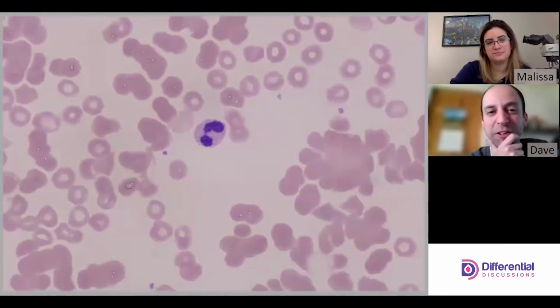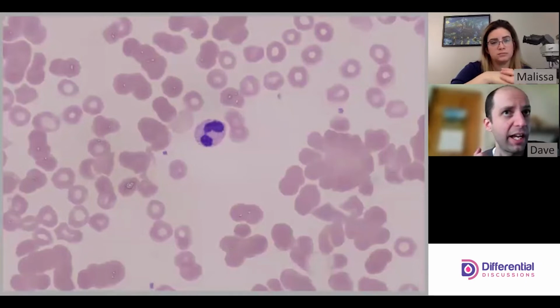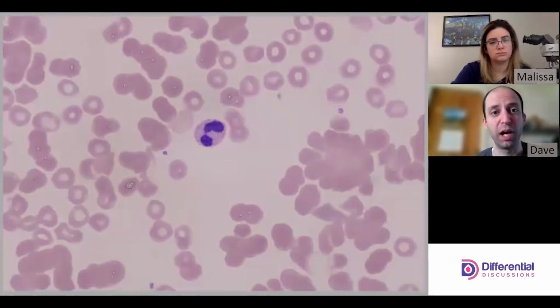Really cool slide, but this one will probably be a little more informative because we can see some normal red cell morphology in the area, and then you see all these groups of agglutination. So more or less what we have is an antibody that's reacting at cold temperatures. People will only become symptomatic or have pathologies when they get into cold environments. And it's also very consequential after the specimen's been collected, right? Tubes don't have body heat. So it becomes kind of an analysis interference to us.